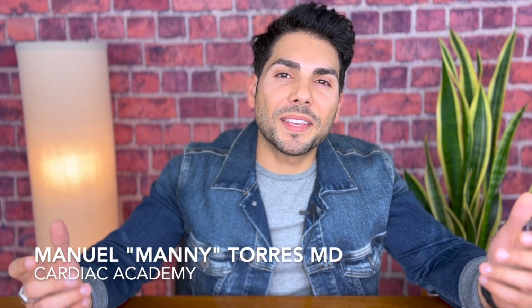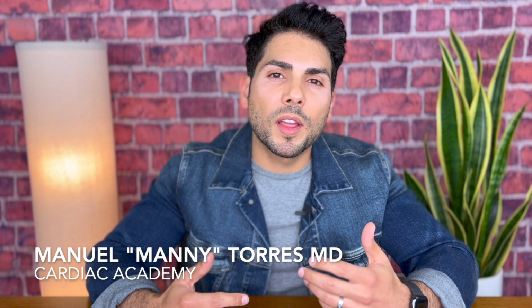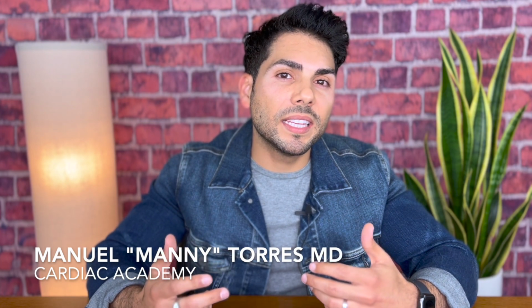Welcome to Cardiac Academy. In this video, we're gonna continue our discussions on EKG interpretation. We're gonna talk about how to tackle EKGs in a systematic way following our very own mnemonic. After that, we're gonna talk about the EKG paper and its different calibrations. And then we're gonna finish up strong by discussing how to calculate heart rate. So without further delay, let's get into it.